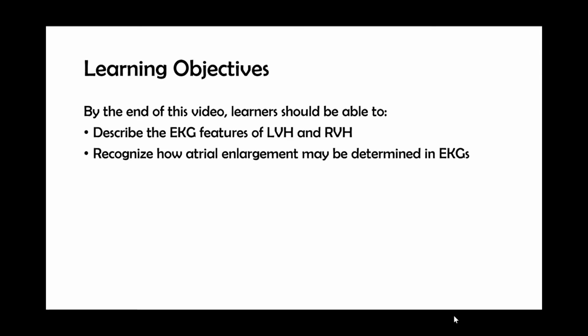Learning objectives for this module: you're going to be able to describe the EKG features associated with left ventricular hypertrophy and right ventricular hypertrophy, and also be able to recognize how atrial enlargement may be determined in EKGs.